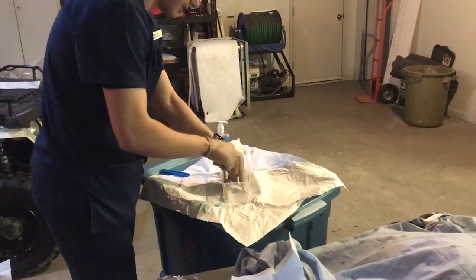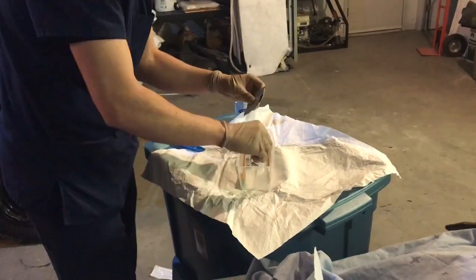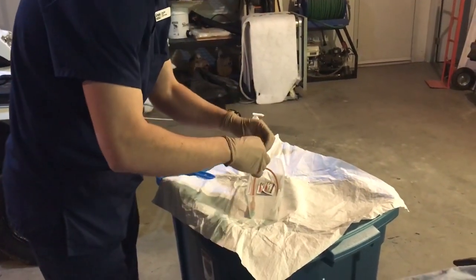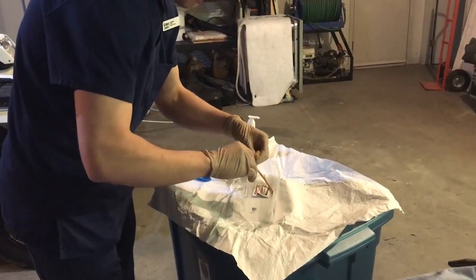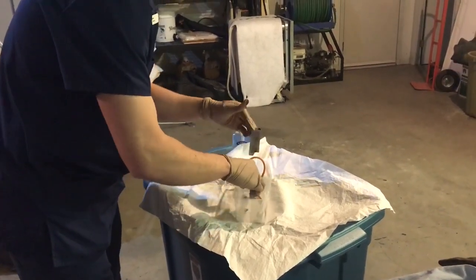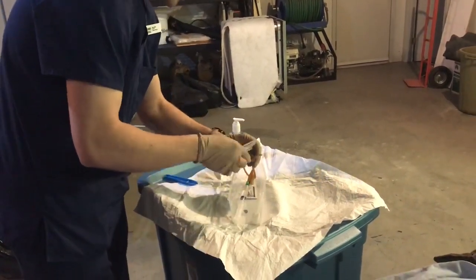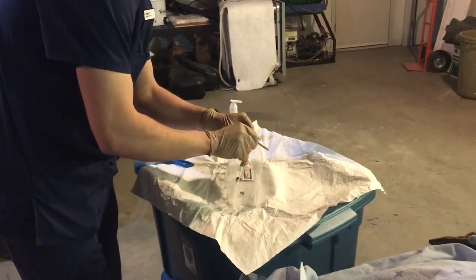I'm also going to inspect the tip, so the tip is intact. I will pull out my swabs, open the swab package, and throw that in the garbage. Then I'm going to open up my sterile water syringe and attach it to the balloon port. Then I will grab a lubricant package, open that up, throw the top out. Then I'm going to lube up a portion of our catheter there.